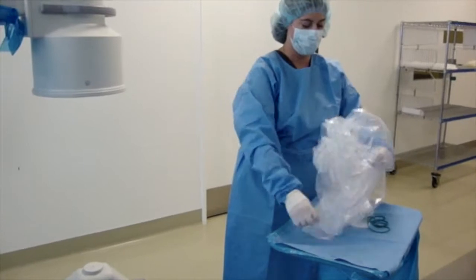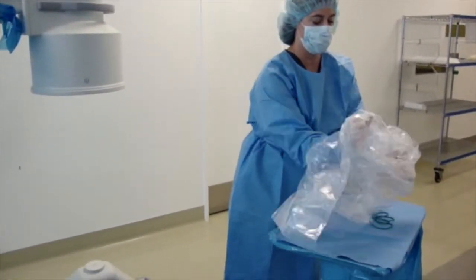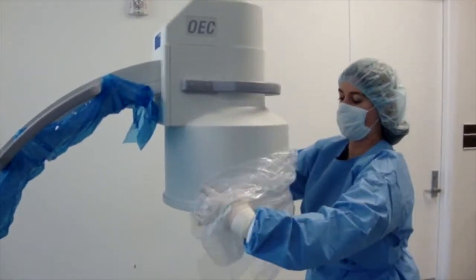Next, apply one of the two clear bag drapes to the top image intensifier. Ensure your hands remain on the outside of the drape as you place the drape on the unit.